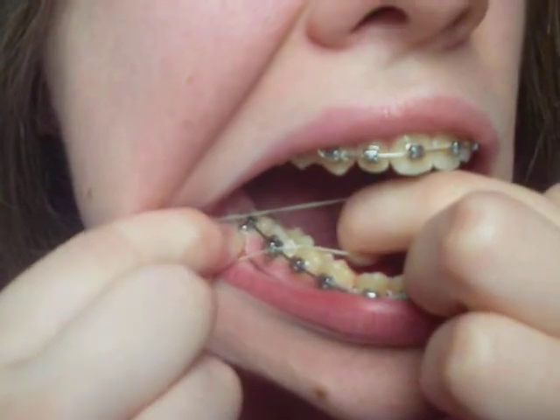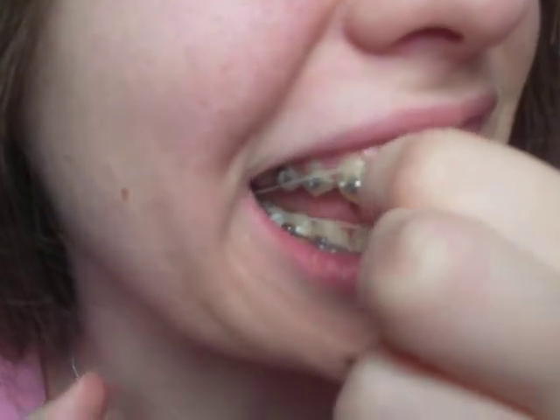The other thing I should say, it's probably easier to put the elastics on when your mouth is partially closed, because obviously the wider open it is, the elastic is stretched, and so it's quite hard. You know, the elastic's not that flexible, and you don't want to end up pinging rubber bands on the inside of your cheek because it hurts. And the same there.